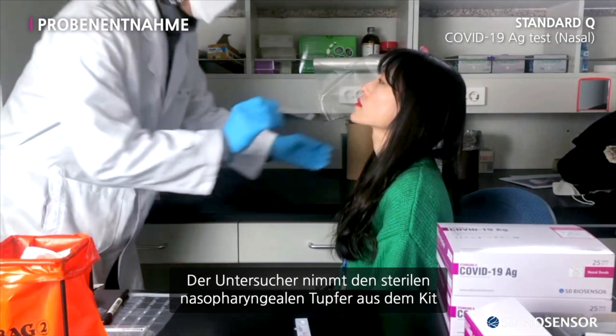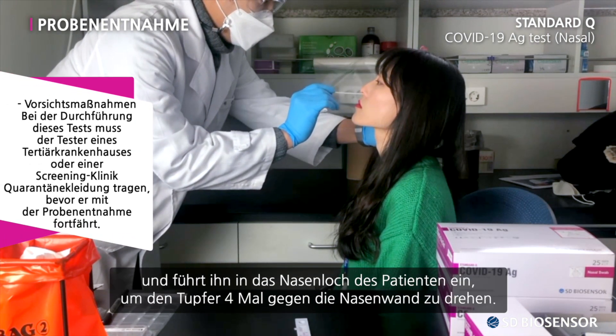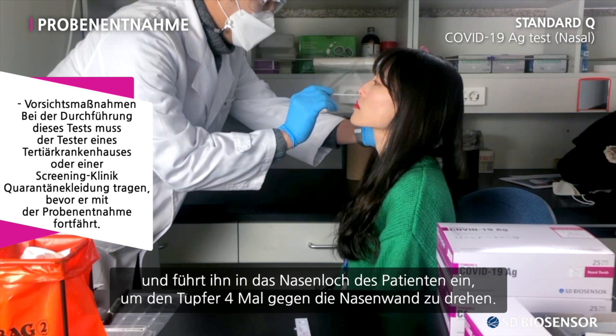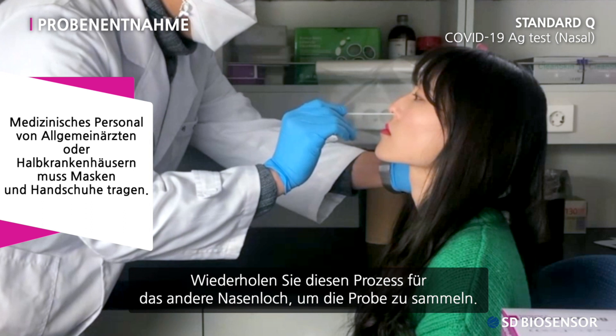The examiner takes the sterile swab in the kit and inserts it into the patient's nostril, rotating the swab four times against the nasal wall. Repeat the same procedure for the other nostril to collect the specimen.